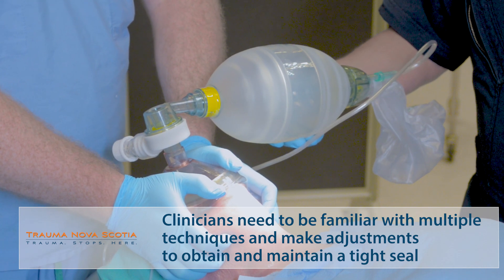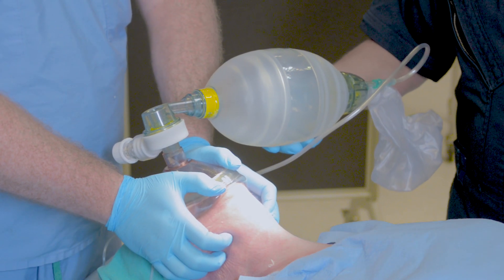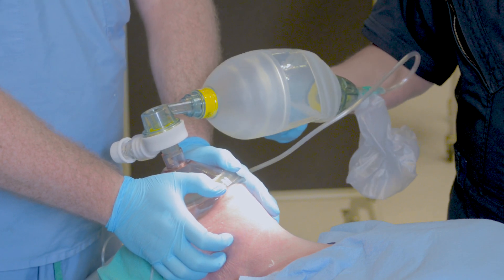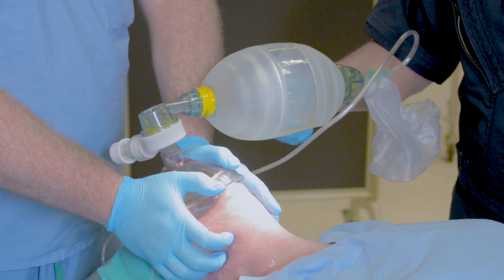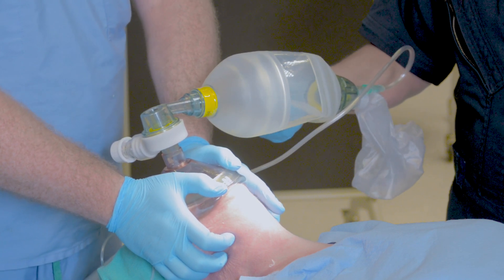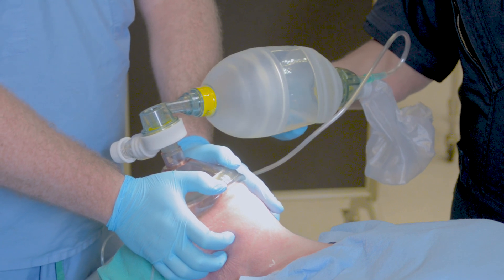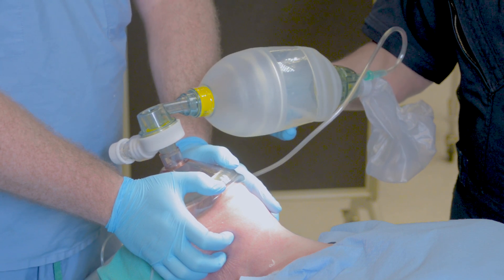The final two in the rule of twos is two providers. The primary provider's both hands are taken up holding the mask and obtaining a mask seal, so a second provider is required. That second provider may or may not have a high degree of expertise, so part of your responsibility as the primary provider is to ensure that the assistant squeezing the bag is not over-ventilating or hyperventilating the patient.